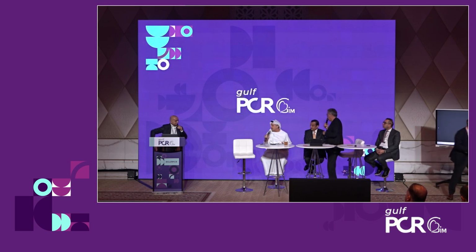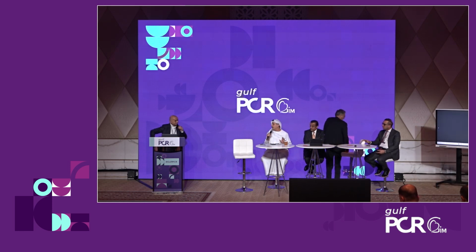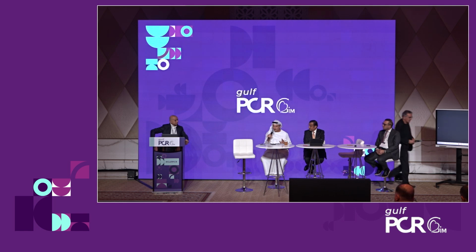I completely agree with this statement. The first patient is the key, of course, for the success of your program. When we started our program recently, a few months ago, the first patient that we enrolled had systolic blood pressure between 180 and 200, and diastolic 90 to 100, on 6 medications. And she was compliant.